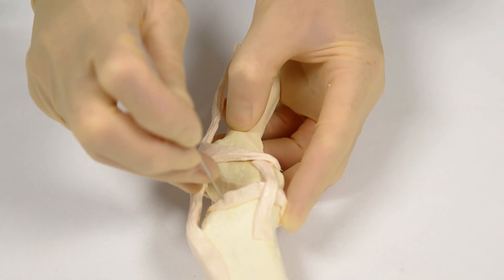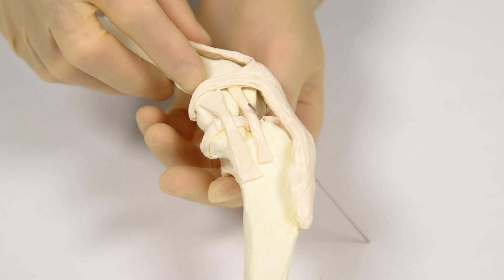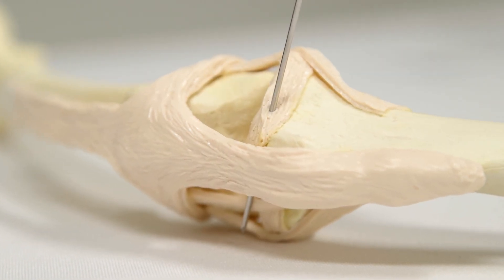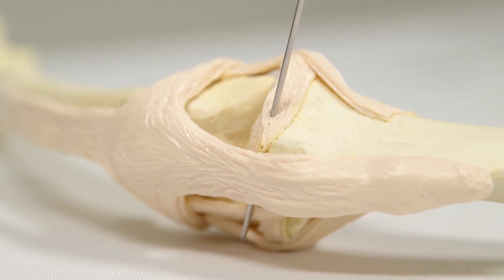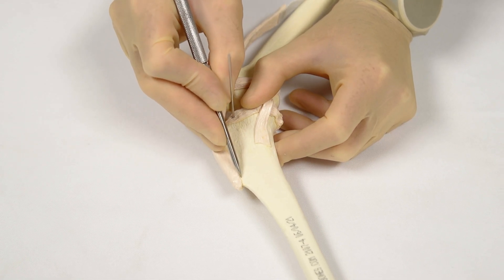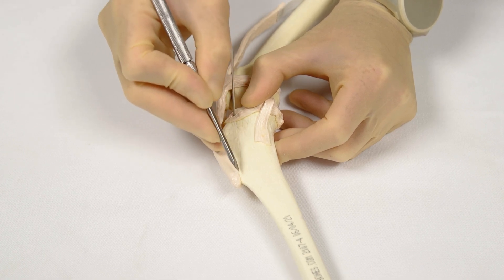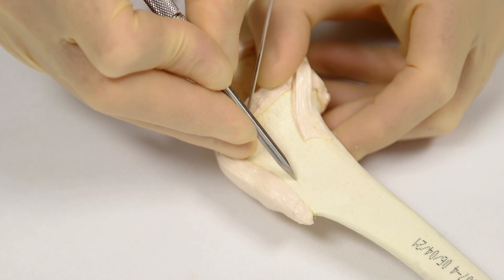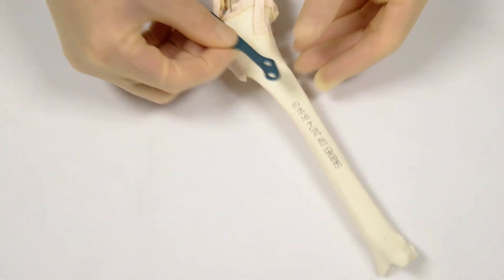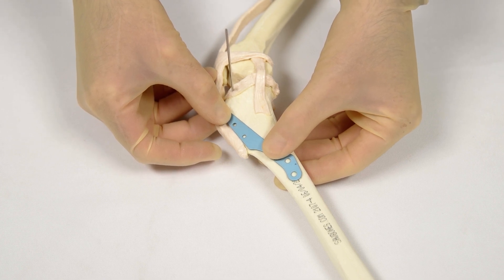Place a K-wire vertically from medial to lateral at the most proximal aspect of the tibia so that it exits laterally over GERDI's tubercle. Medially, the K-wire identifies the location of the proximal osteotomy. Using a bone scribe or diathermy, mark the line of the osteotomy between the K-wire and the intended finish point where the distal concave curve of the base of the tibial tuberosity joins the main tibial cortex. Check plate size and positioning relative to the prescribed osteotomy mark and the tibial tuberosity.